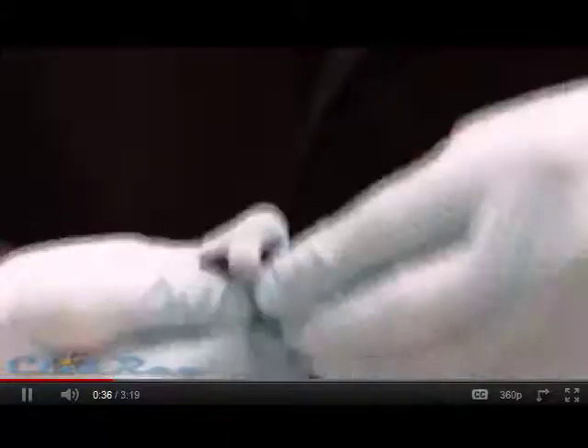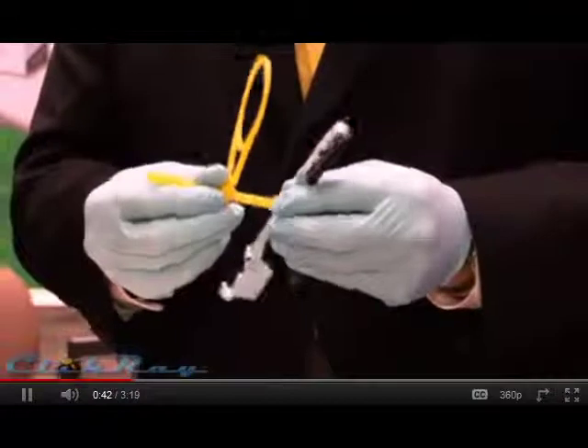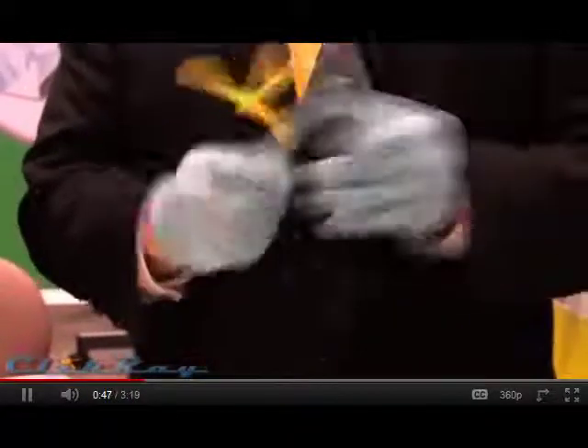You can put it on the other side, directly in the middle, take the ring off, replace the ring, and now the patient holds this for an anterior view. It's also available in a periapical-type view for endodontic treatment.